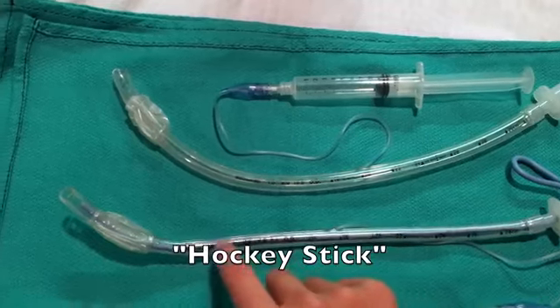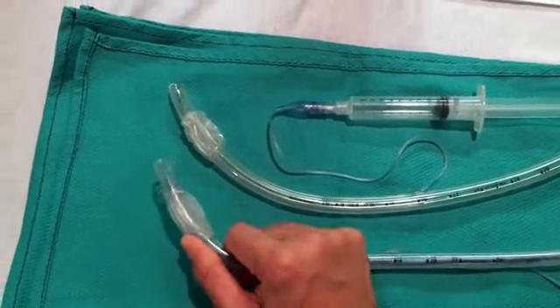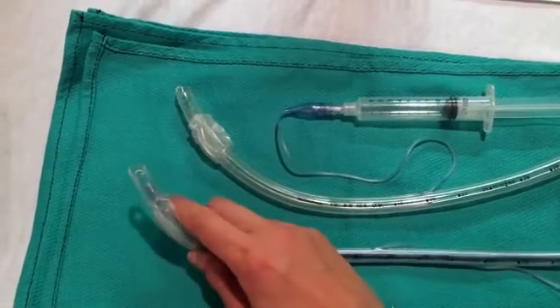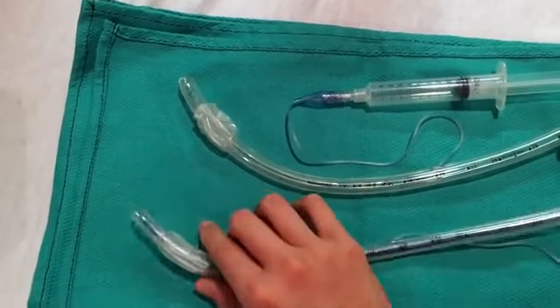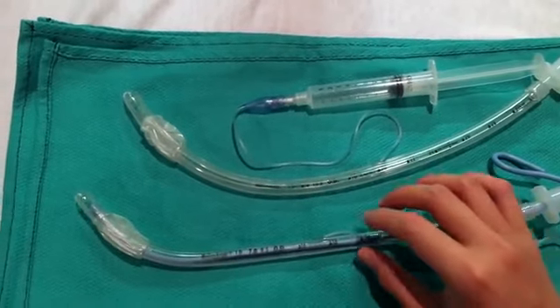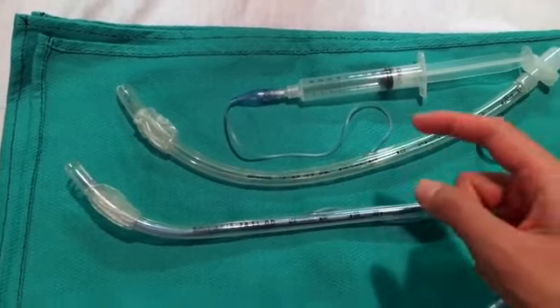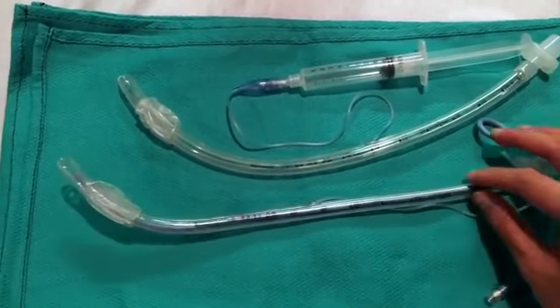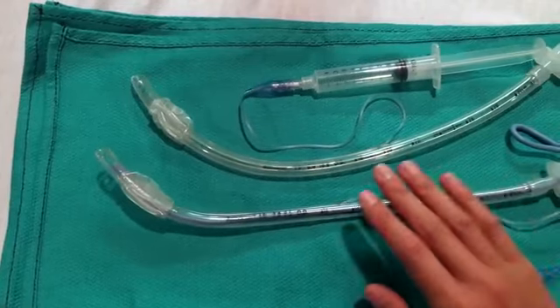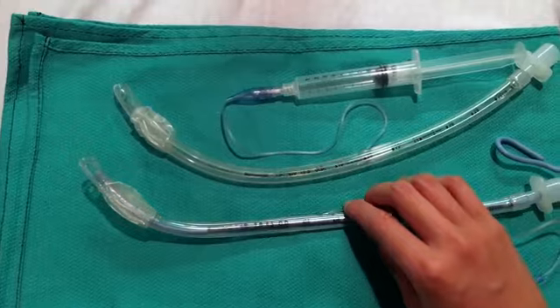It should go straight, then at the end, you can manipulate the stylet to curve it more or less. That allows for easier passage into the trachea, and hopefully helps to point it upward when you're intubating instead of going down into the esophagus. So those are some of the parts you would check on an ET tube, and also just the parts of the ET tube itself.